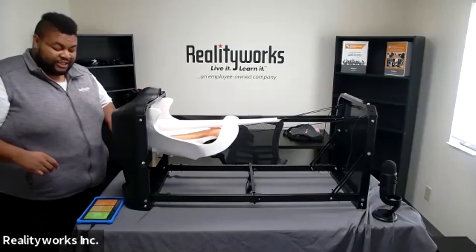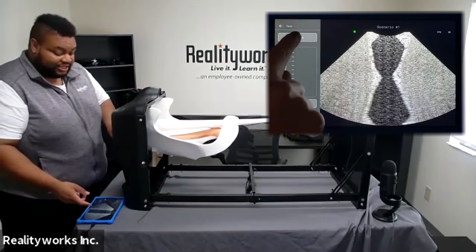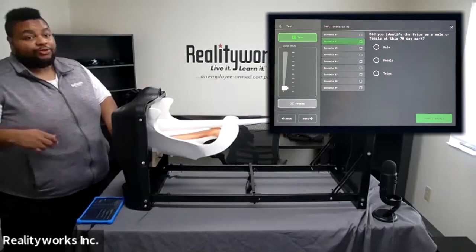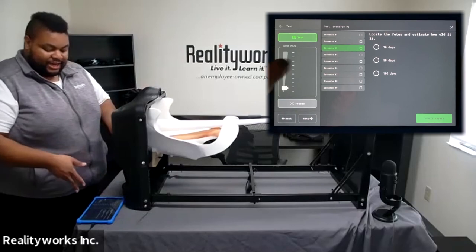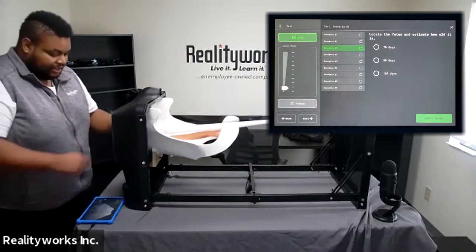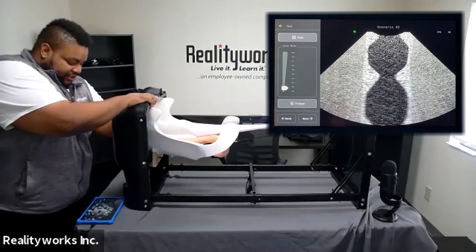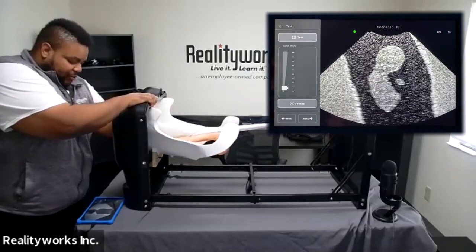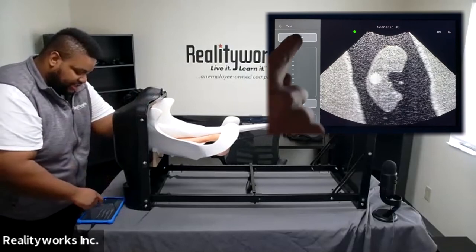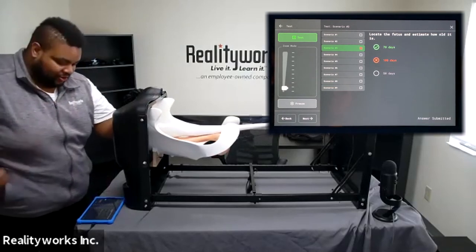Test mode is very similar to practice and simulation mode. Click the test option; at the top left of the screen you'll see the test button, and it will list the different scenarios the student can go through. For each scenario, there will be a question and a multiple choice answer for the student to select. Once you have the selected scenario, use the probe, take a look at what you're seeing, and once you're at the right view, click the test button. Answer the question and click submit answer, and it'll tell you whether you have it correct or incorrect.